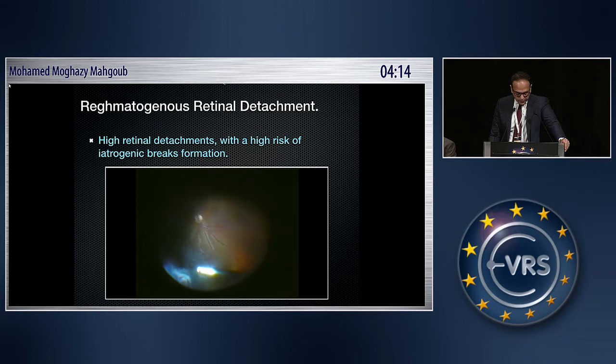In high retinal detachment with a high risk of iatrogenic break formation, you can drain the retina — not necessarily completely — immediately after PVD and core vitrectomy, and then you can easily and safely remove the peripheral vitreous.